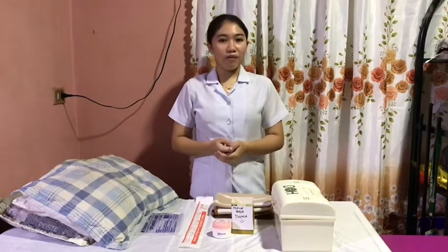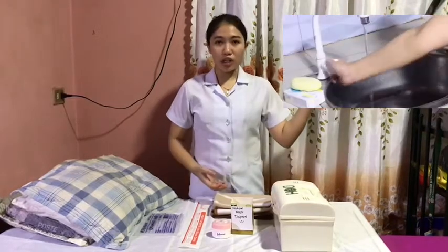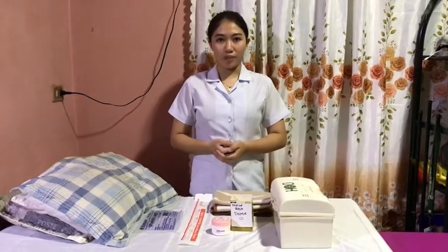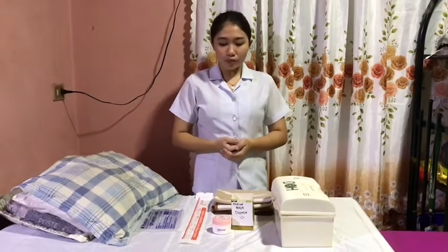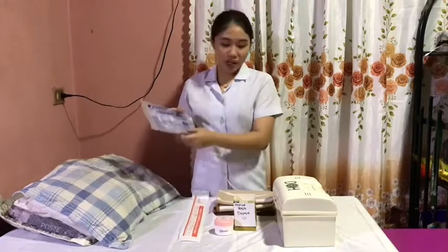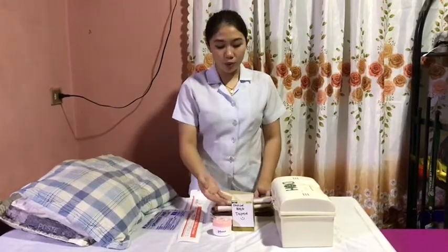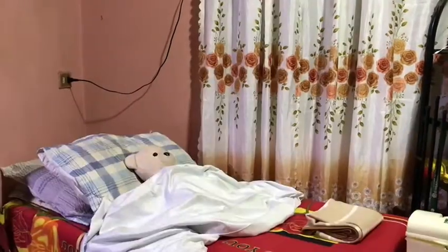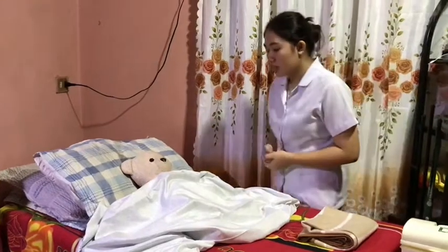And also, I have already performed hand washing to deter the spread of microorganisms and to prevent the spread of infection and contamination. Next, I have prepared the necessary equipment needed in this assessment because preparing the equipment can save time and energy. Alright, so I have here a two-way Foley catheter, a drainage bag, medical waste disposal, a lubricant, and a catheterization set.